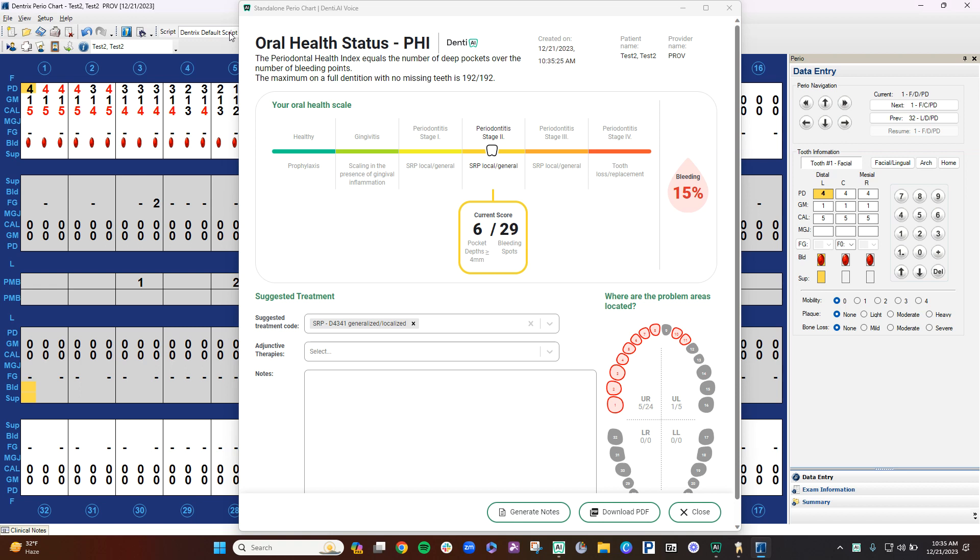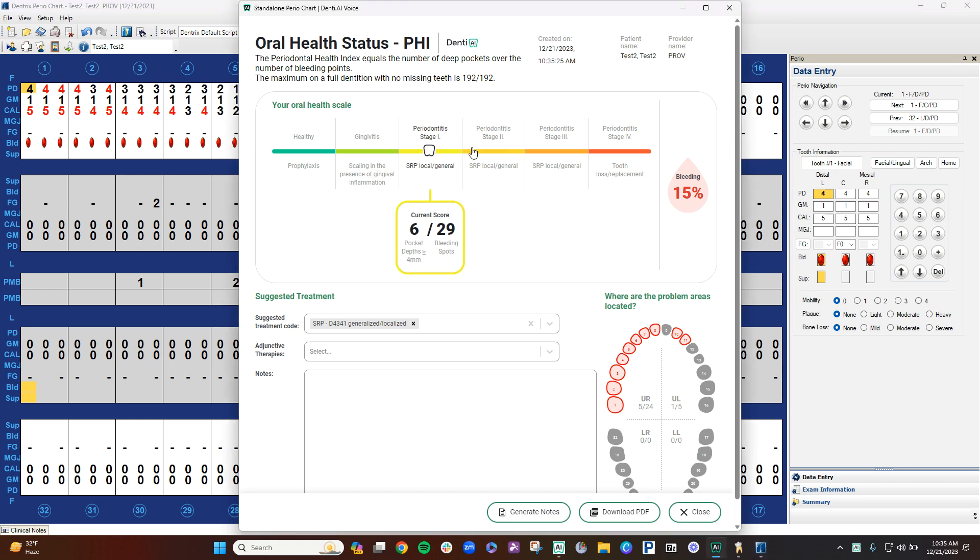The other thing it does is it gives you bleeding percentages. So first off, I will show you in the stage here, you still need to look at the images as a hygienist. You need to make sure that that radiographic bone level matches what you're seeing on the perio chart. If you need to adjust it, you just have to click into a different box here. For now, I'm going to just go ahead and keep that at stage 2.